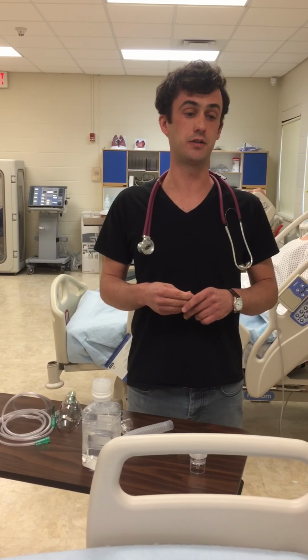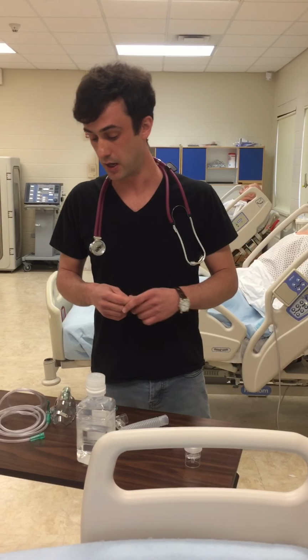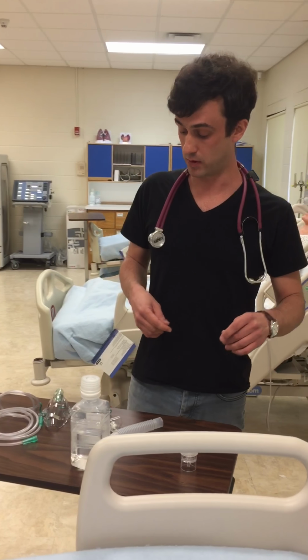So before entering the patient's room, I would check the physician's order and check the patient's chart for any significant data, including medication, dosage, and frequency. I would then identify and gather my equipment.